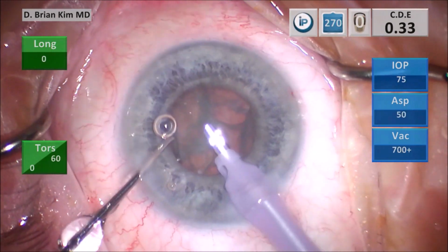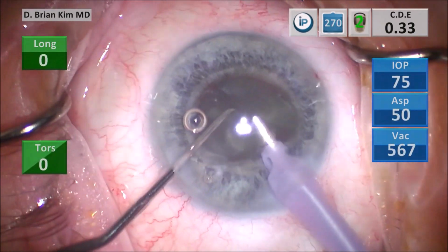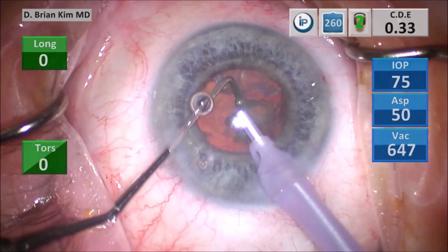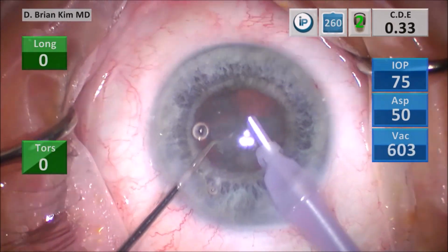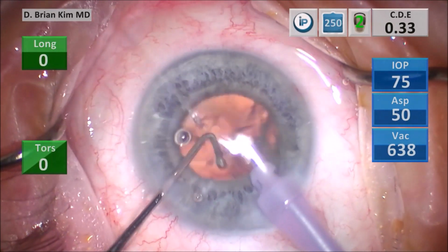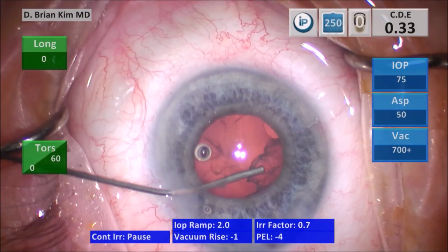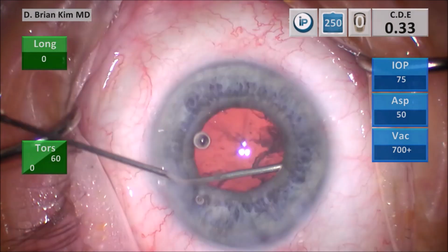I remove my epinuclear material. I use my chopper to lift the epinuclear material away from the PC, and then I'm able to get a very nice removal of the epinucleus doing this technique. I'm flushing some of the epinuclear material with my cannula, and then I go to my IA.